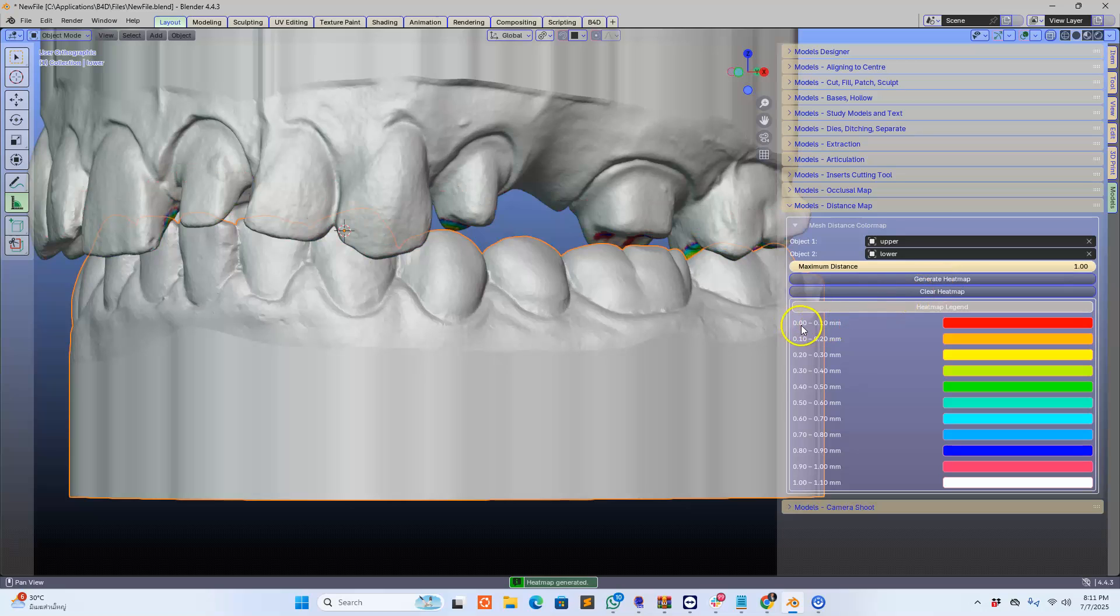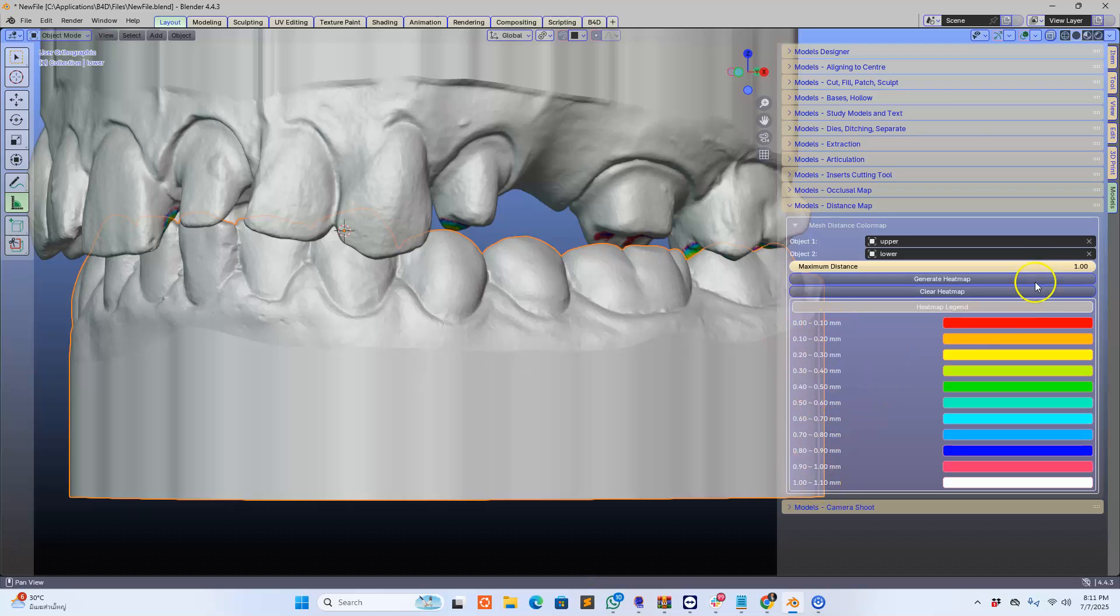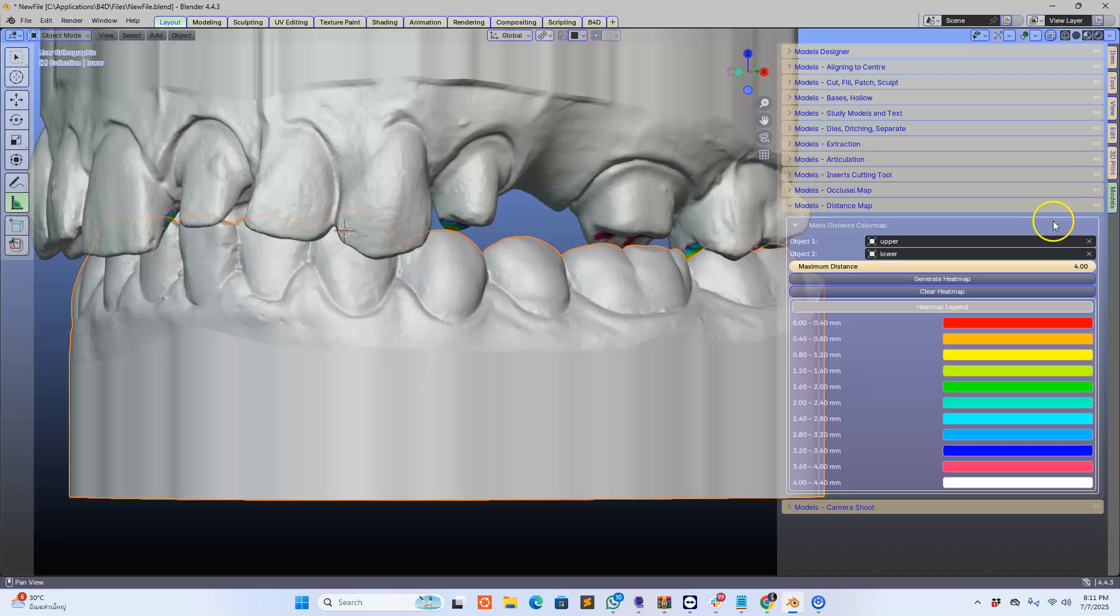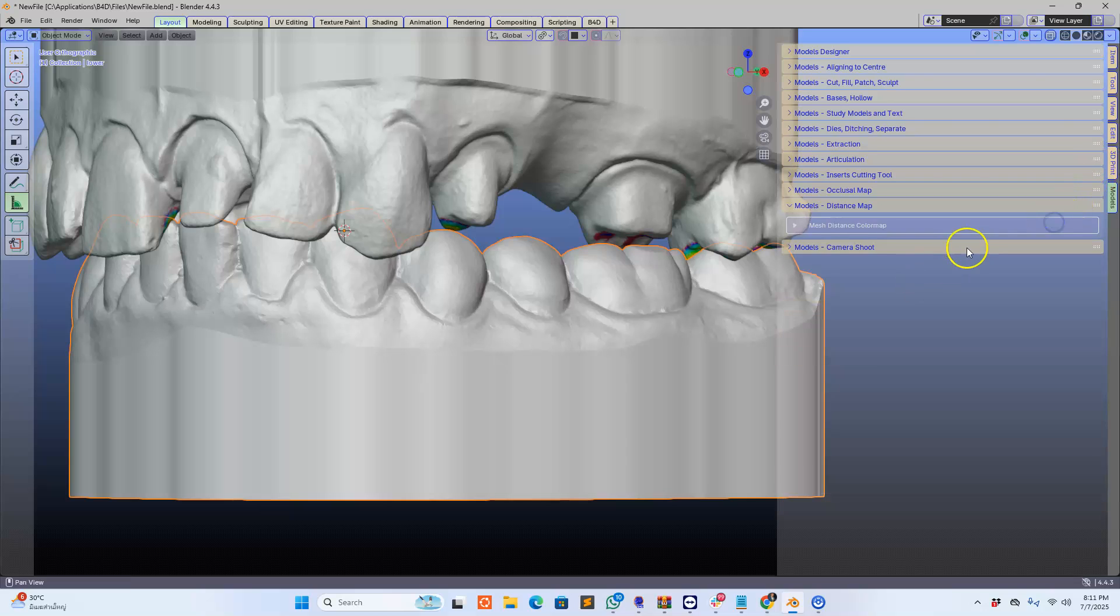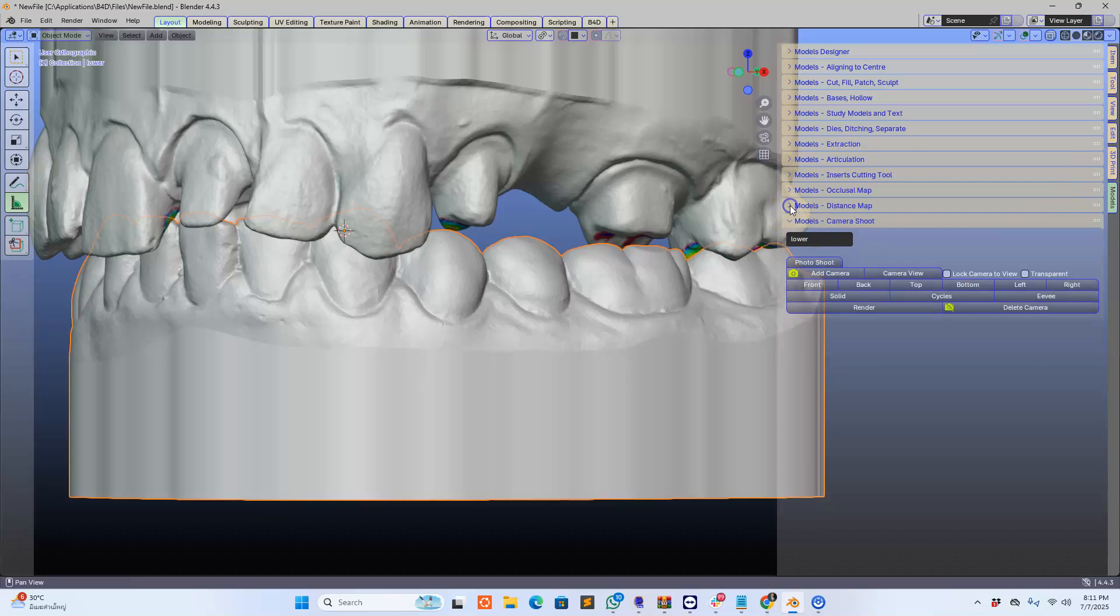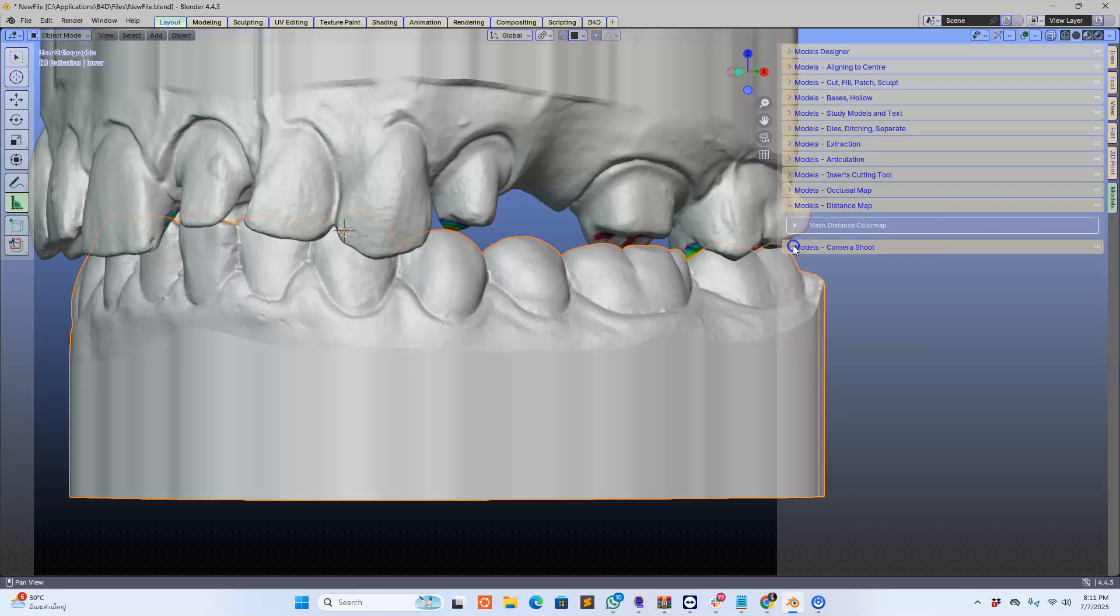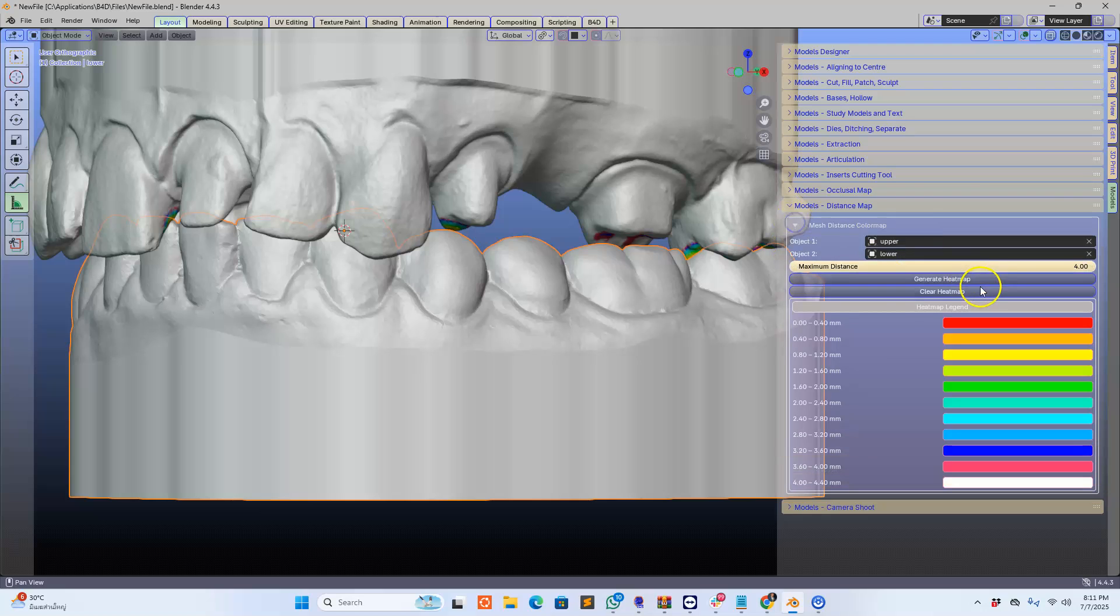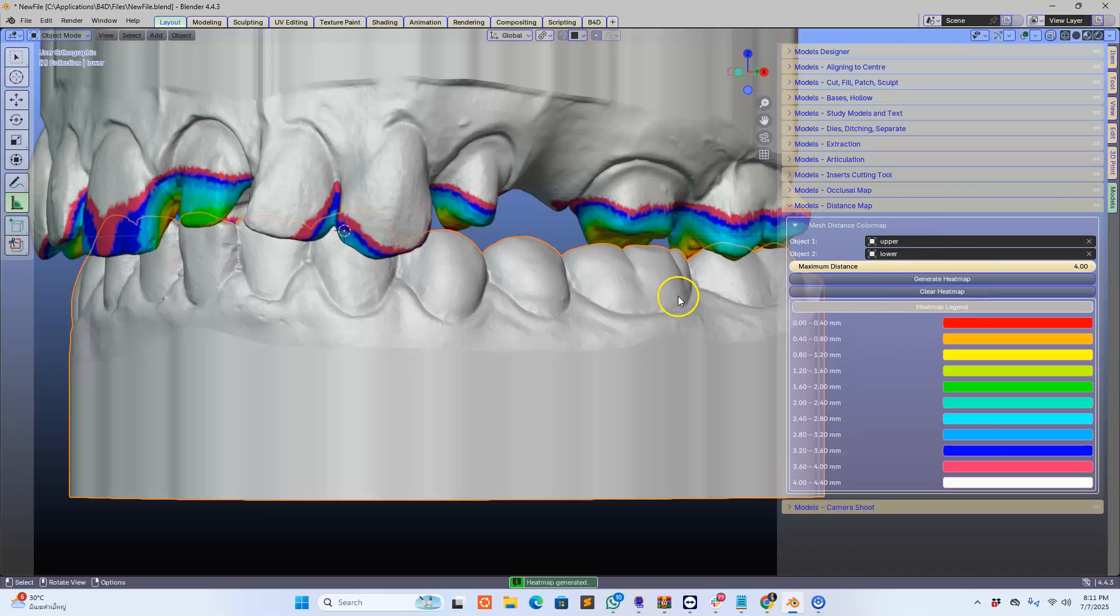So this is zero point nothing to very small increments and measurements. Put this back to four like that, and then let's generate the heat map again. Here we go.